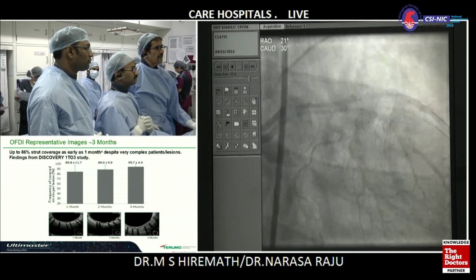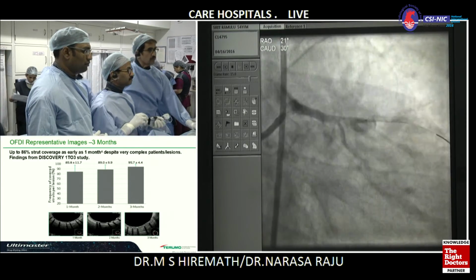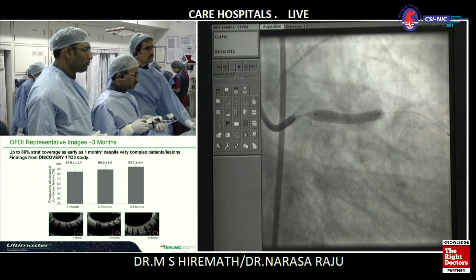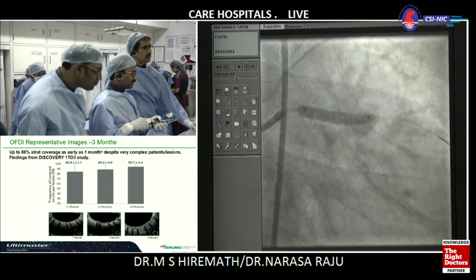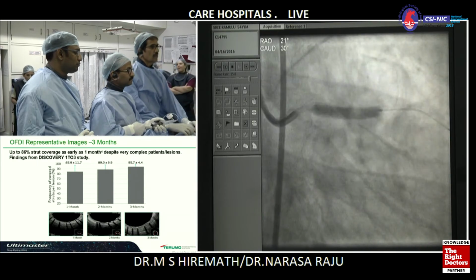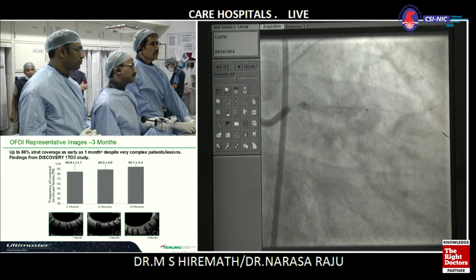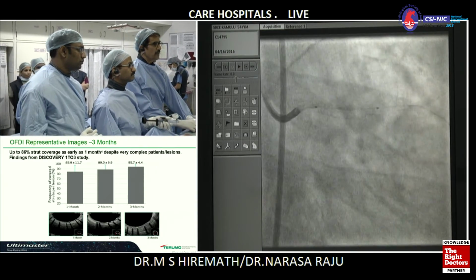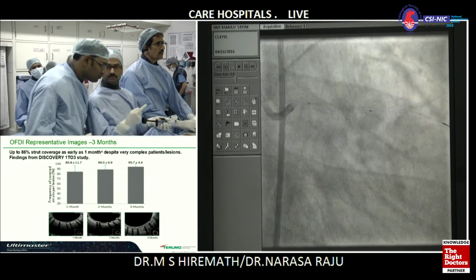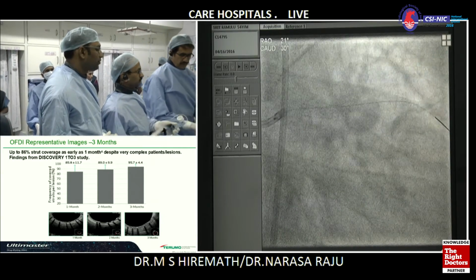See, we have to go very high on the proximal portion. Yes, I think we're okay. We go up quickly to 3 and gently to 8. Okay, at 10, stop. 10, 8. Enough. So this is a 4.0 going to 8 and 10. We have stent boost. Oh, we'll do it later.